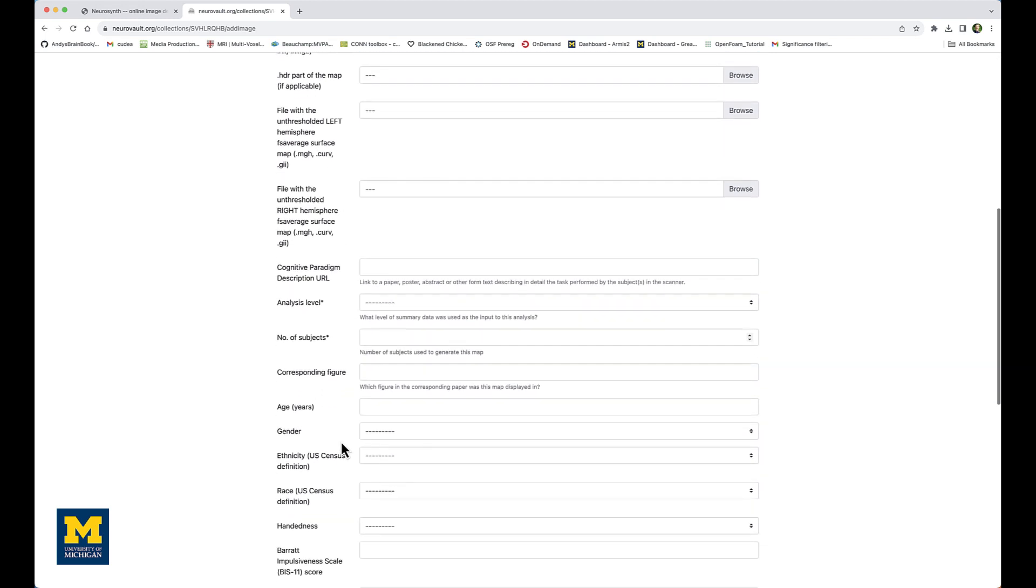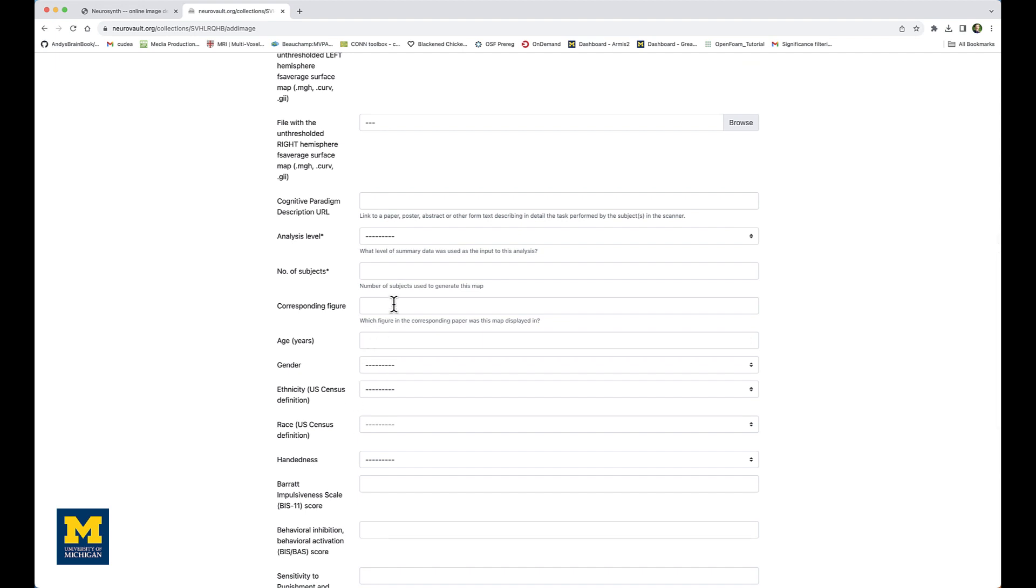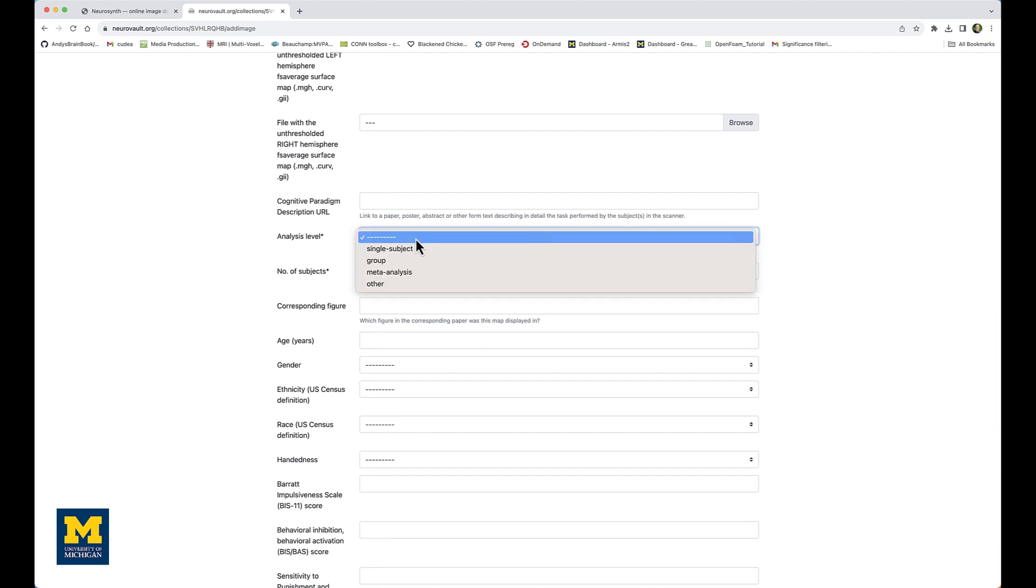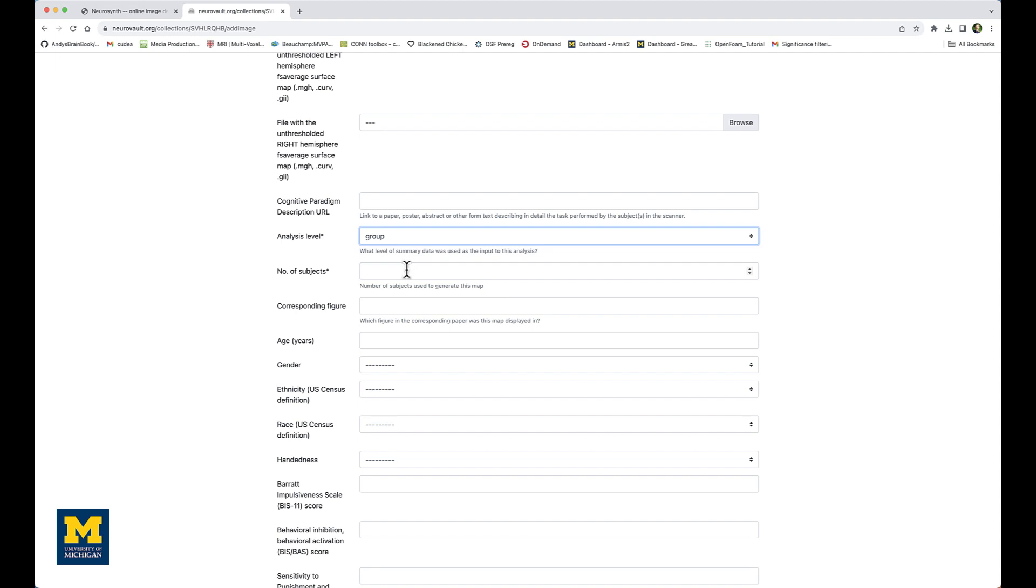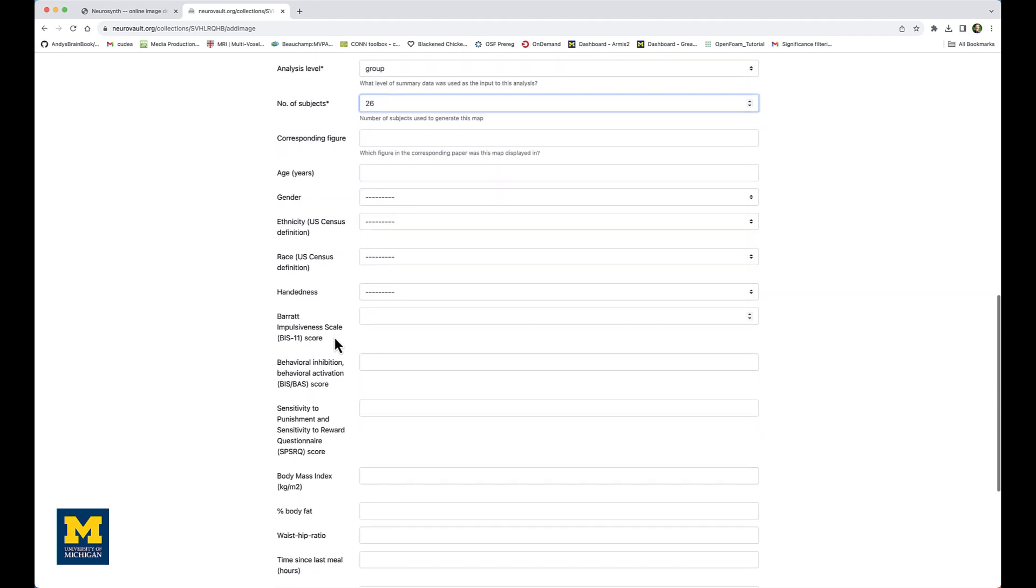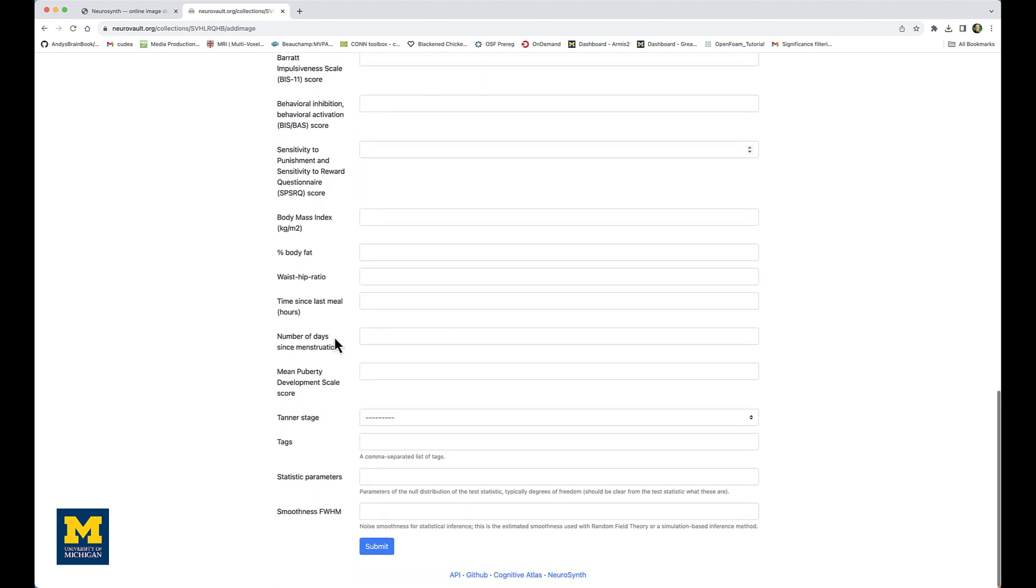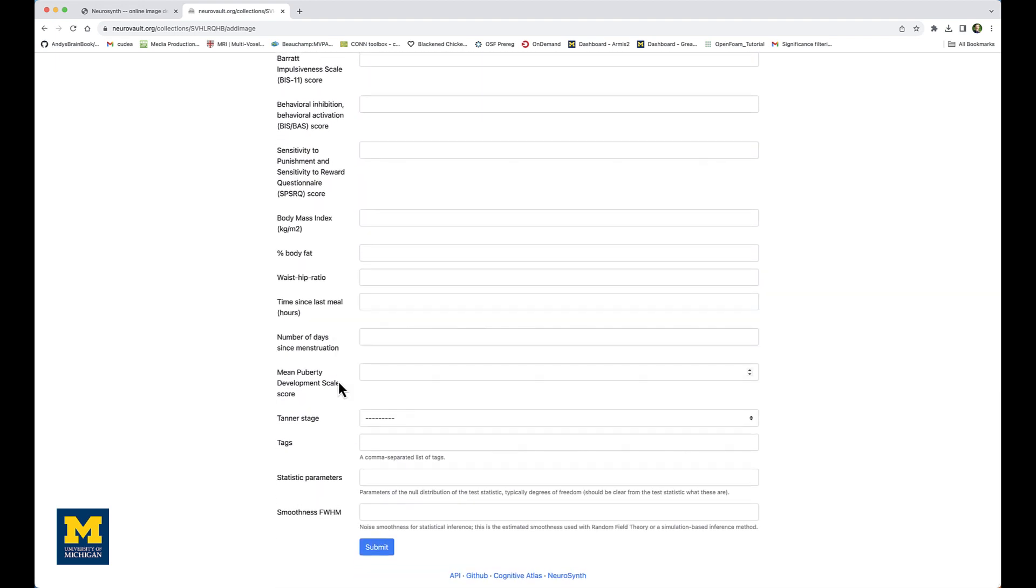For now, I'm just going to fill in the rest of the required fields, such as group level analysis and the number of subjects, which is 26. I'm going to skip the rest of them, such as age, gender, handedness, and so on, and just click on Submit.